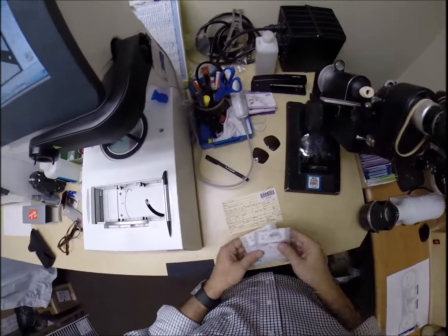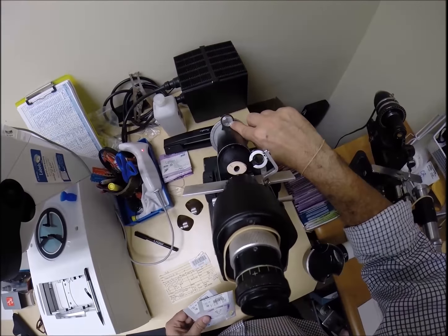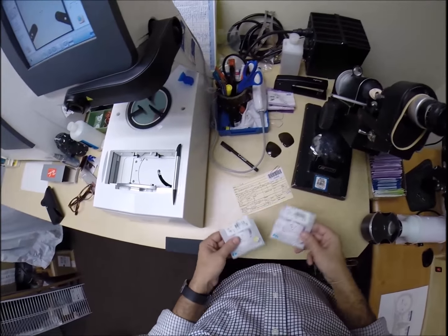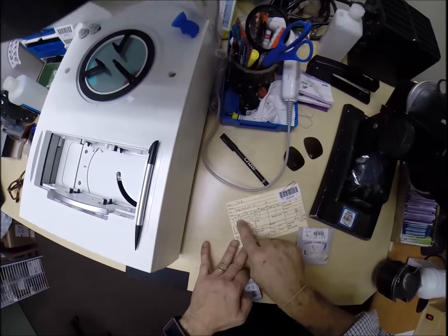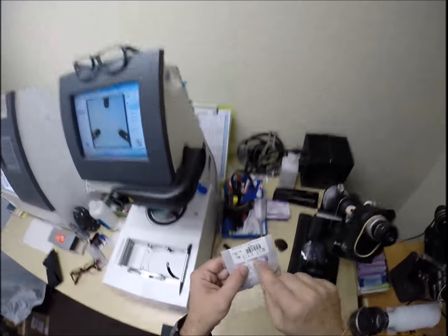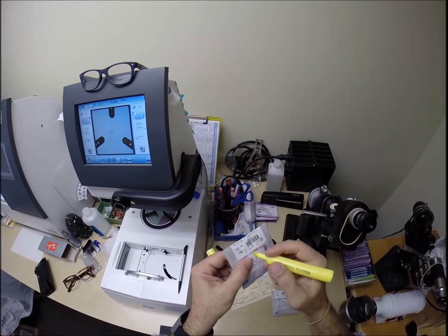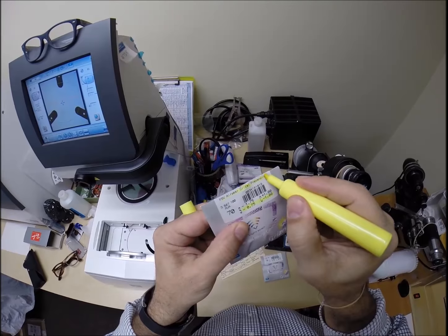They're still warm. We're going to spin the axis wheel to 180, which is going to be 0 tonight, because 0 and 180 are the same number. You didn't learn that in math? Yeah, it's okay. Trust me on that one. So your right eye reads minus 75 minus 1 at 180. Minus 75 minus 1. Let's go ahead and do that. Highlight that. And of course, these are the Crizal Prevencia lenses.